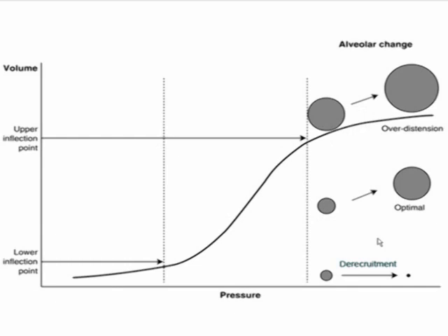Now, why is this important? Well, what this scale forces you to do is, if a patient is satting poorly, what's going on is that their alveoli have to be shunting. Because once you get beyond about 40% FiO2, the only real problem that could be causing the patient to be hypoxic is shunt. And if the alveoli are shunting, the solution to that is increasing the mean airway pressure. That is increasing the PEEP.